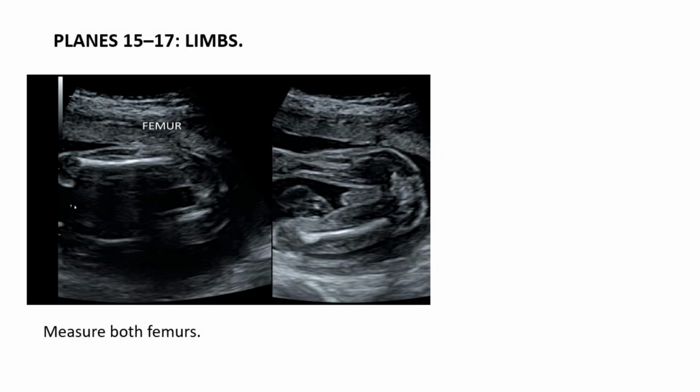Plane 15, femur length. From the pelvis, slide and rotate to obtain a true longitudinal view of the femoral diaphysis. Measure both femurs. Refer if femur length falls outside the normal range.